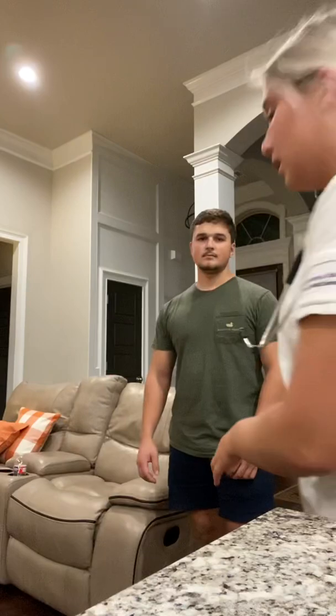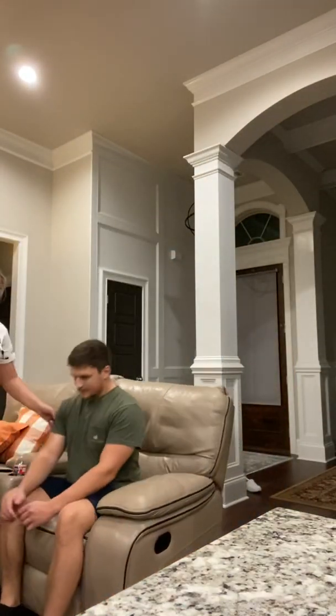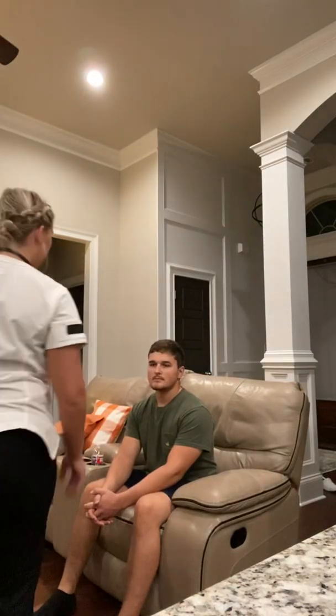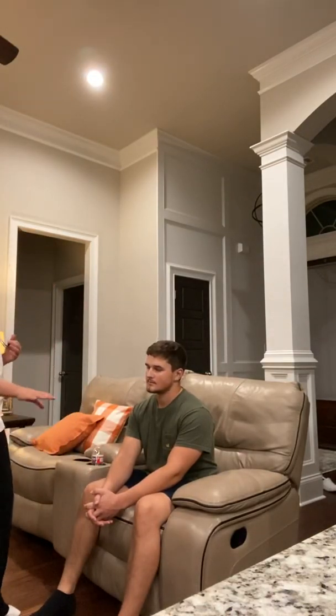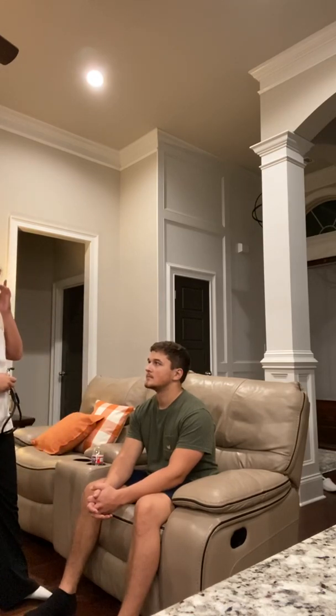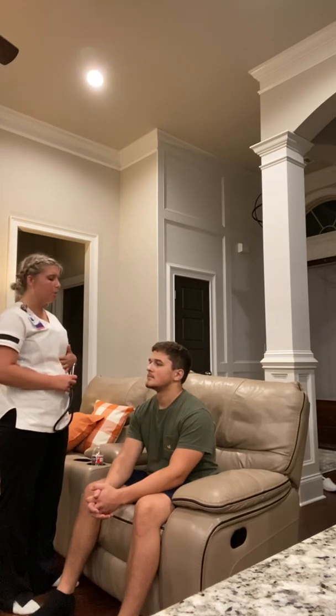Okay, I'm gonna go ahead and assist him back to his chair. Okay, you can sit back down. And his gait and balance were excellent. Okay, now I'm gonna go ahead, and did you have any pain while doing that at all? No, okay. Now I'm gonna go ahead and assess your lung sounds. Okay. And every time my stethoscope touches you, I'm gonna get you to go ahead and take a big deep breath in. And before I do this, are you having any pain or struggling to breathe lately?